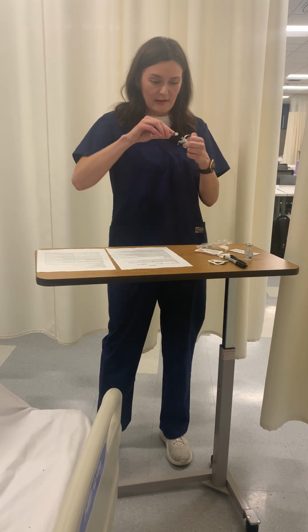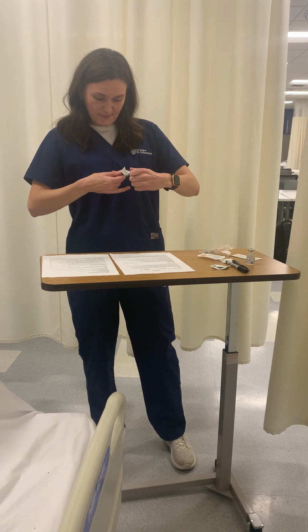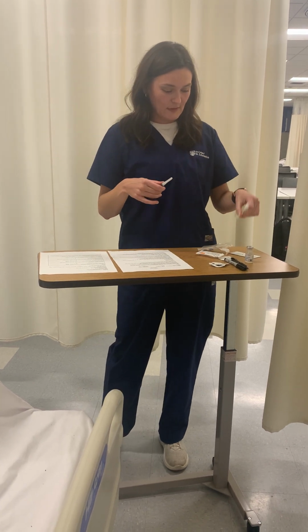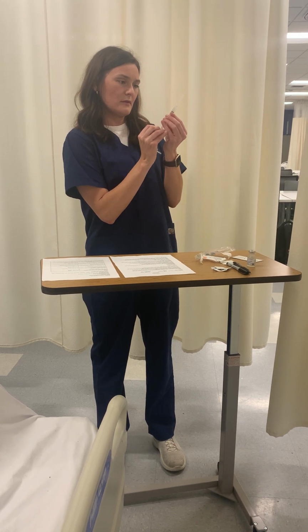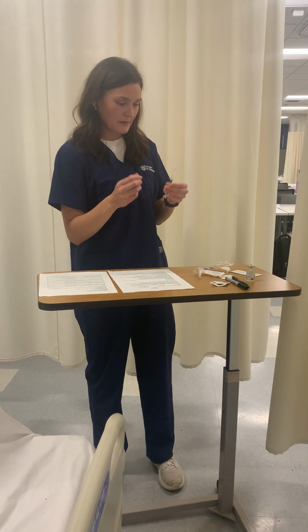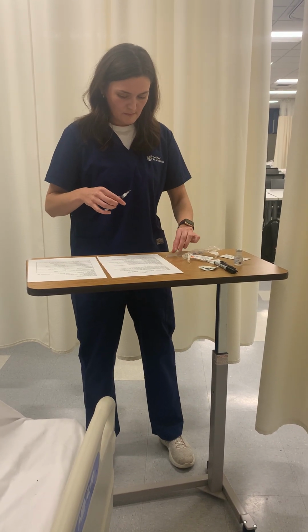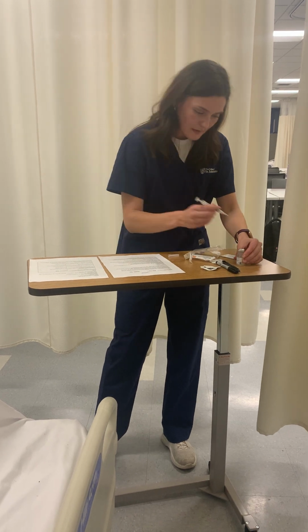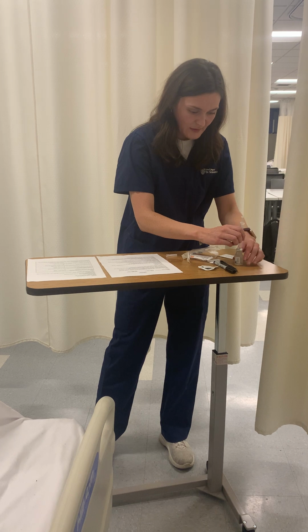Actually, I don't think I do it that first. I'll attach this first. Okay, there we go. Now I'll do 0.5 mL of air. Okay, this is dry. I'm going to insert 0.5 mL of air.